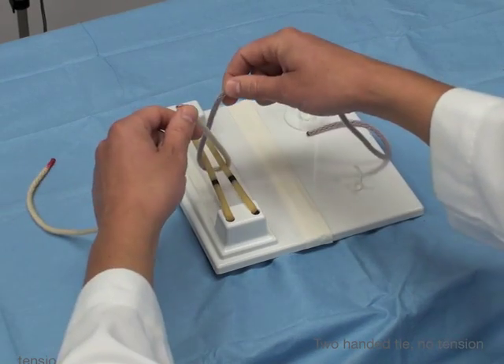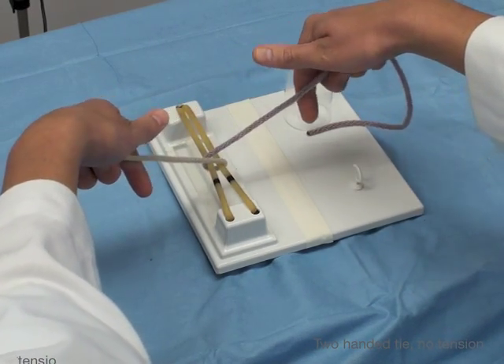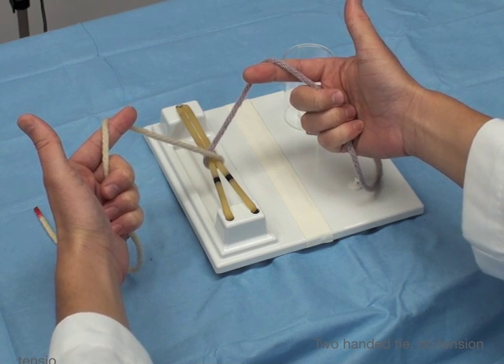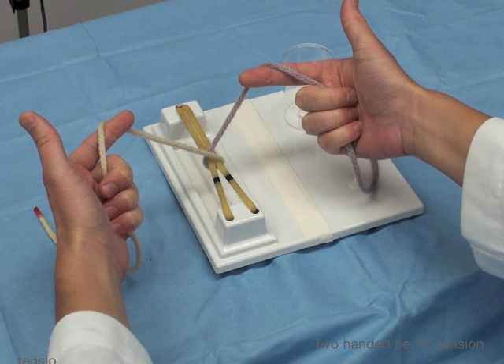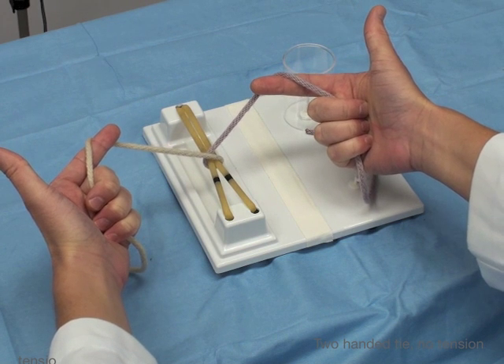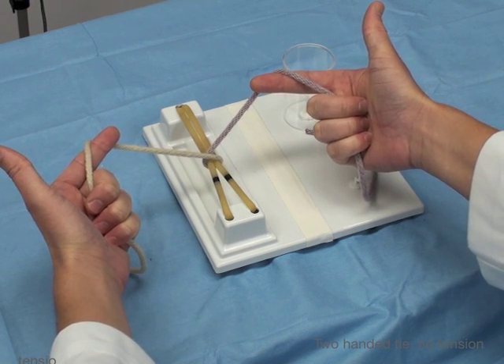To set up, we've got ourselves crossed. Then you get your pistol position. You hook your barrels, and then with the third through fifth digits you're holding the strands. So I'm in pistol position. I've hooked my barrels. I'm ready to go.